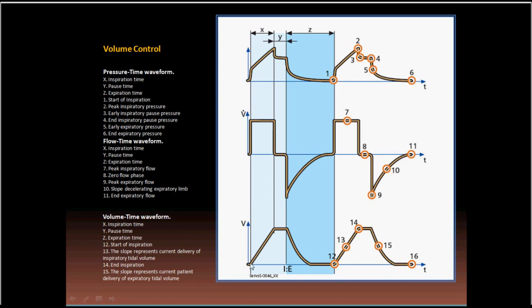When it comes to the tidal volume, this is inflation. This is the preset tidal volume. This is the level of the tidal volume. It starts from 0 to this value, say 500. And then the tidal volume is trapped in the lung during the inspiratory pause, and that's it. Soon after that, you deflate it and it comes back to 0. From this point, which is 500, will be the 0 for the expiration, to come to the 500 and the expiratory reserve.